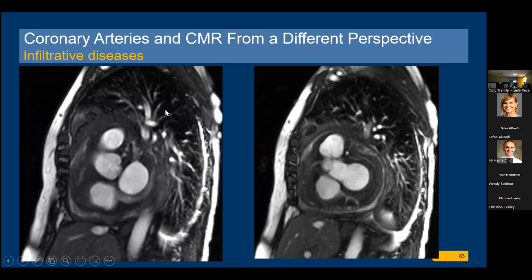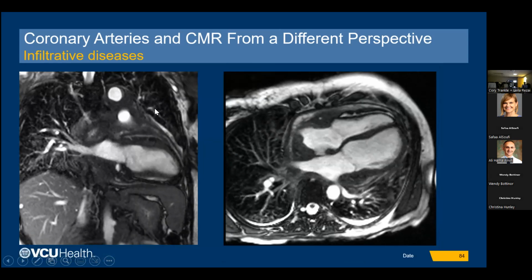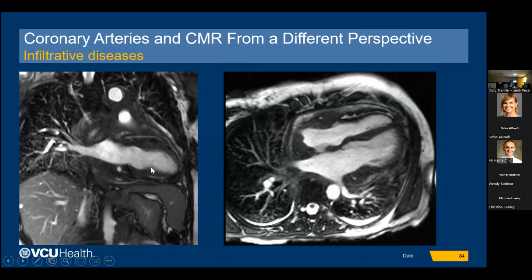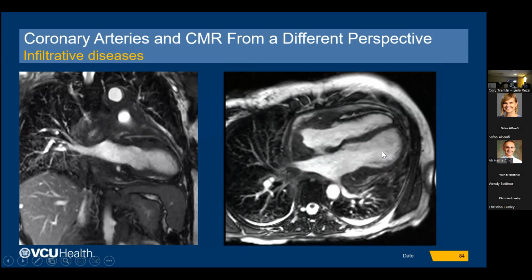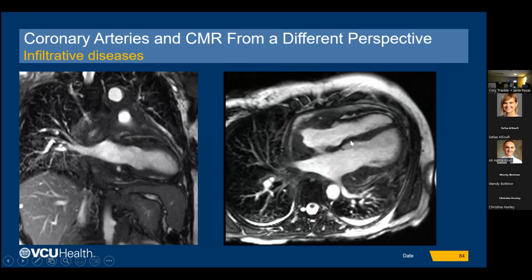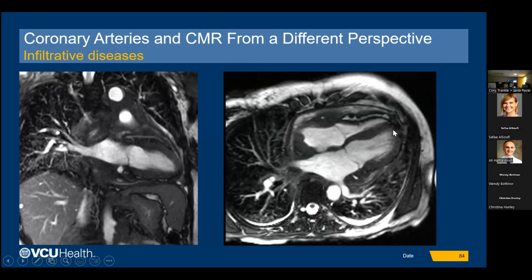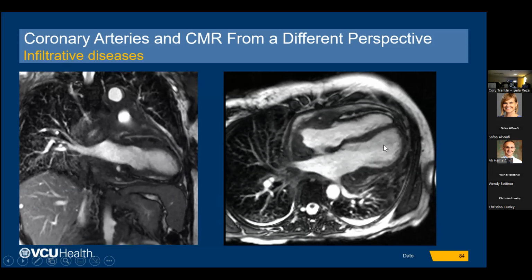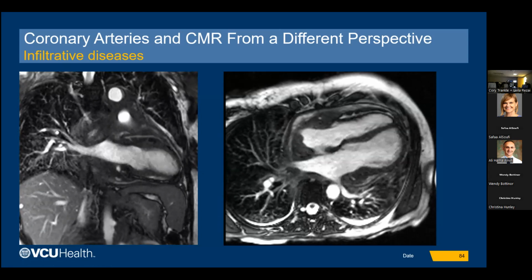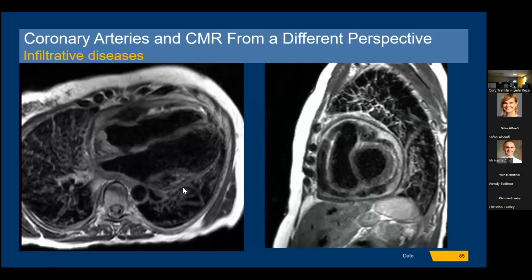We also have pleural effusions and involvement of the lung. Many images in 2-chamber and 4-chamber views show the same. Although the EF may not be so bad and the wall motion is not that declined, we still have septal bounce and tubulation of the ventricles, which tell us that there is a component of constriction here, caused by the infiltration and by the pericardial involvement.